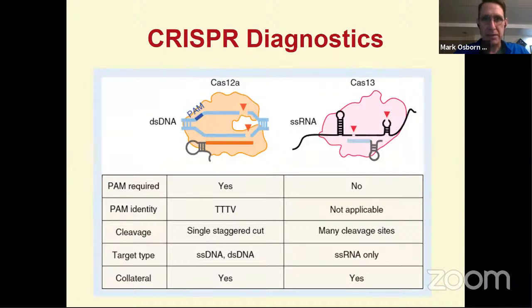So in the evolution of CRISPR diagnostics, the key entryway into this diagnostic space was really forged by Dr. Jennifer Doudna, who of course received the Nobel Prize last year, and Dr. Feng Zhang, and their laboratories have been pioneers in the overall CRISPR-Cas9 space, as well as other Cas enzymes. And it really is defined on the properties of these Cas enzymes, where they can bind a user-defined sequence, whether that be DNA or RNA, and then they mediate an effect, typically some kind of nuclease event.